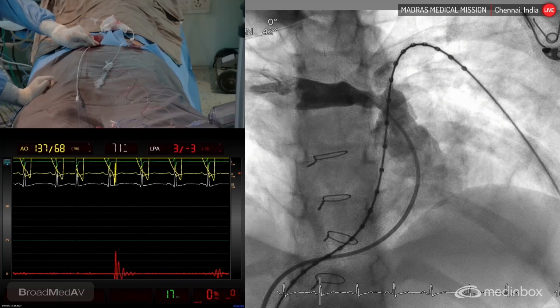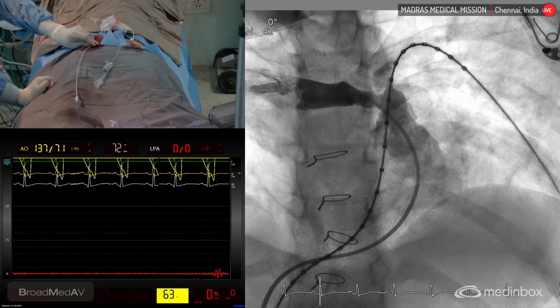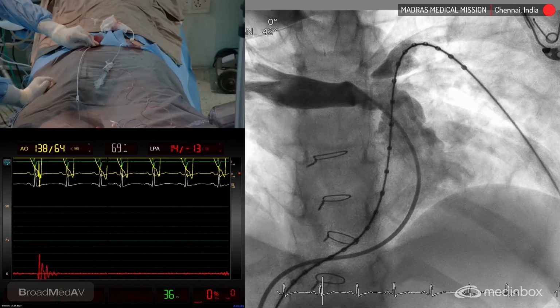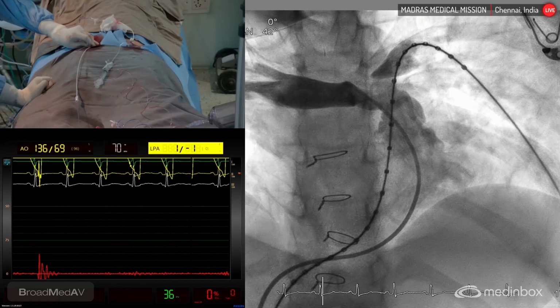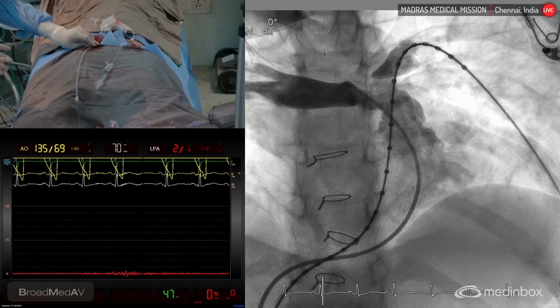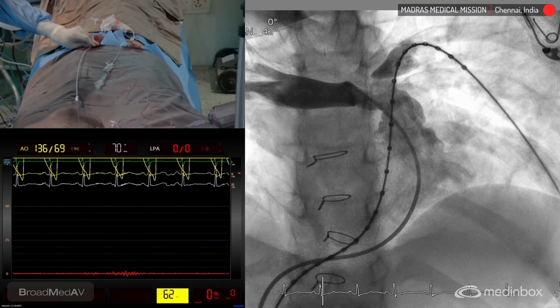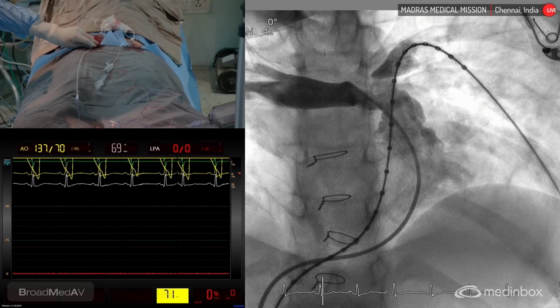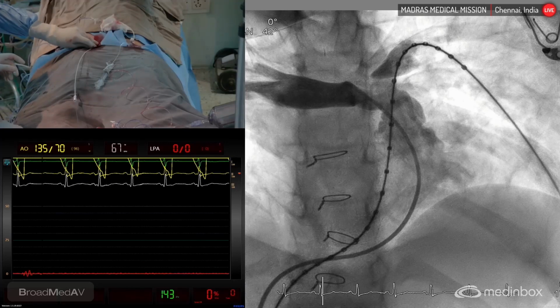Okay, this delineates the distal narrowed main pulmonary artery, the origins of the right and the origins of the left. Next frame. So there is a sharp kink of the left pulmonary artery, which you can see as an overlapping contrast. Let's get another view here. Go to lateral. Full lateral.